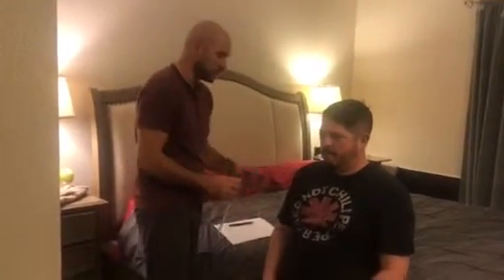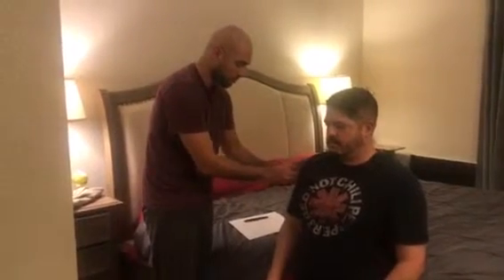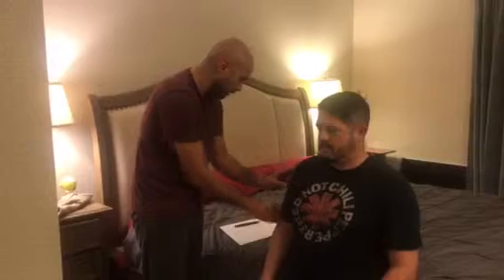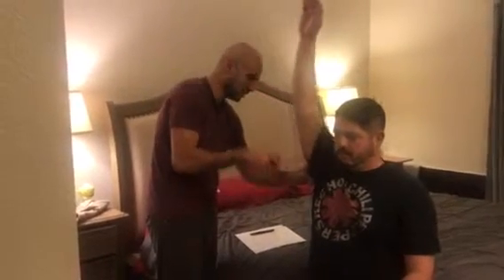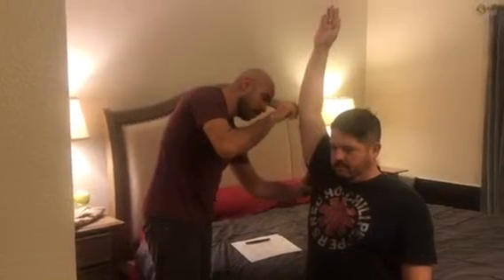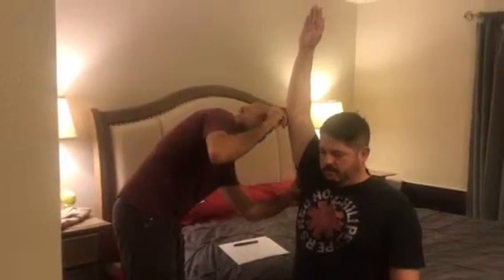The first one we're going to do is the shoulder flexion. Mario, go ahead and sit up straight. We're going to put the fulcrum right about the acromion process. Go ahead and lift your arm up. We're going to have the stationary stick down and bring this up — and relax. So we're going to be right about 169 for your right arm.